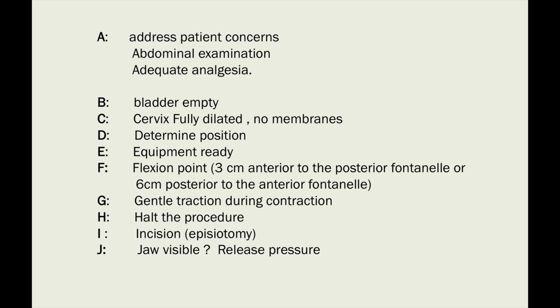And this flexion point, we need to apply the cup so that the center of the cup should lie exactly on the flexion point. Okay? Don't worry, I will show it to you now. And the letter G stands for gentle traction. So gentle traction, and the traction must be only during contractions. You can't ever pull in between the contractions.